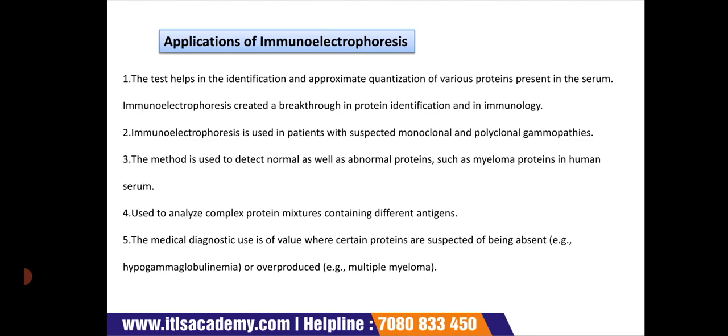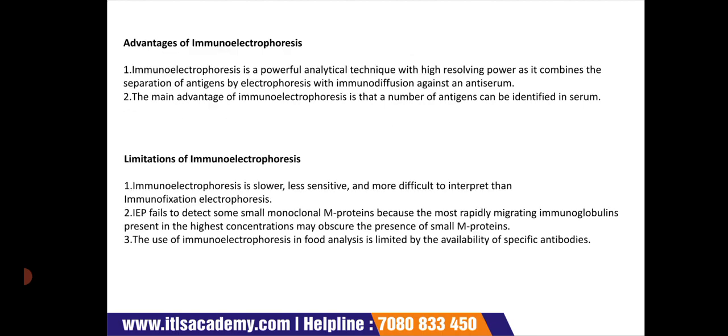Immunoelectrophoresis is used to analyze or detect that. They are also used whenever you want to analyze complex protein mixtures containing different antigens, and in medical diagnostic use, where certain proteins are suspected of being absent or overproduced. So these are certain applications of immunoelectrophoresis that you should always know.